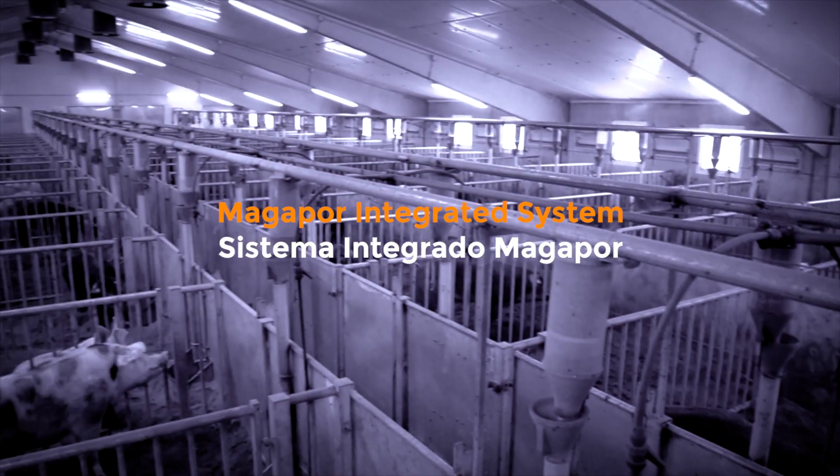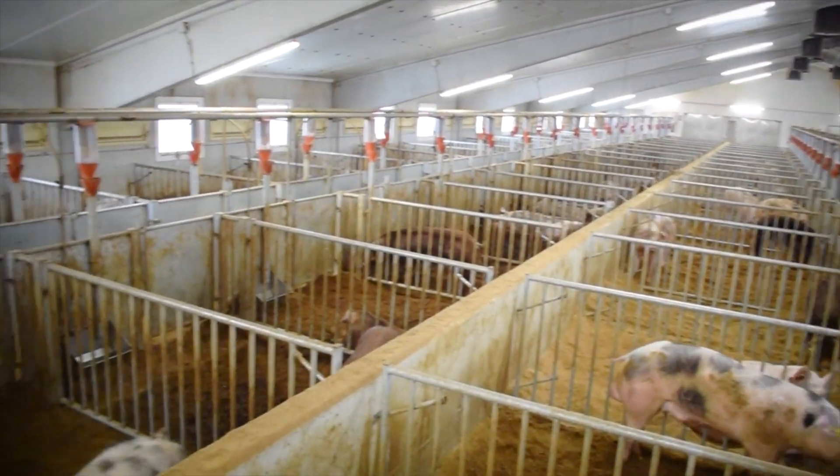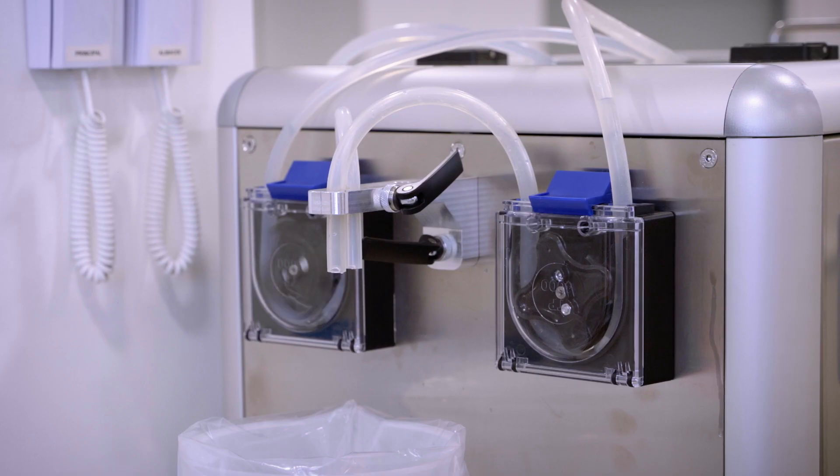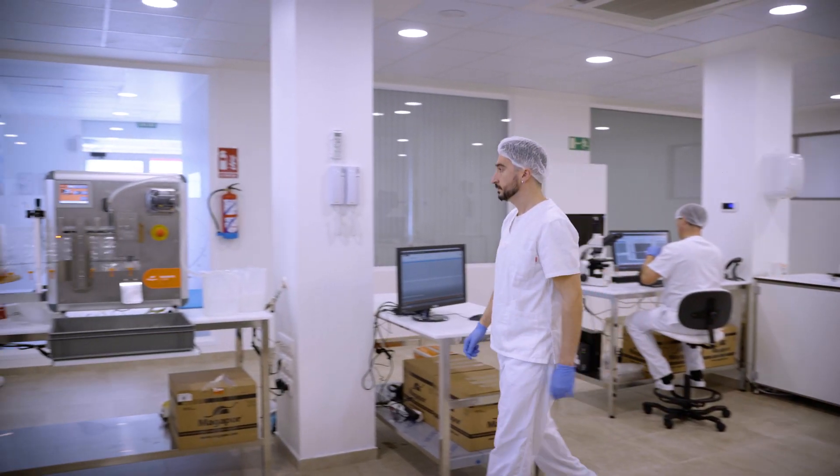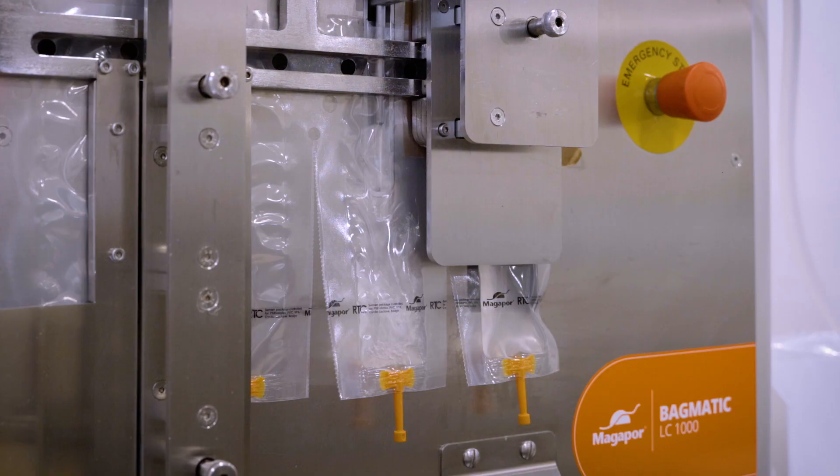The Magapor Integrated System is a working concept developed by Magapor that integrates and automates all the semen dose production process with total traceability. Versatile and efficient, it adapts to all the needs, forms of work, and size of the boar studs, evolving with the know-how and experience of Magapor.